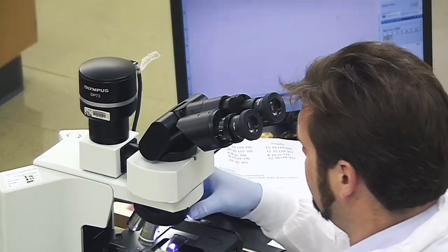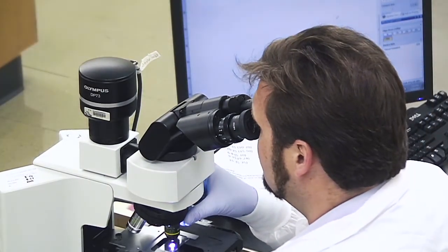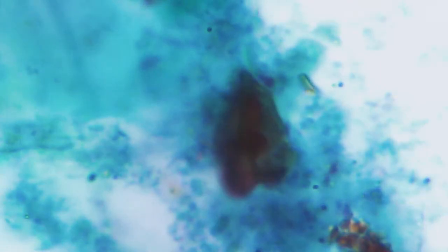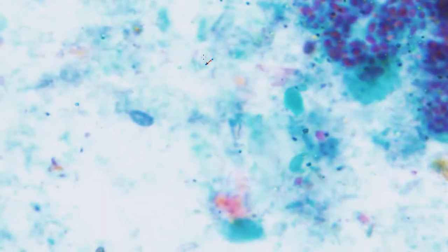So I'm just going to once again focus my microscope and then bring it back into focus for you. Here we go. Okay, and down to 100, and we'll maximize this view for you all to see on the screen. So now this is, once again, trichrome stained feces. This contains trophozoites and cysts of Entamoeba coli. Let's see what we can see in here.